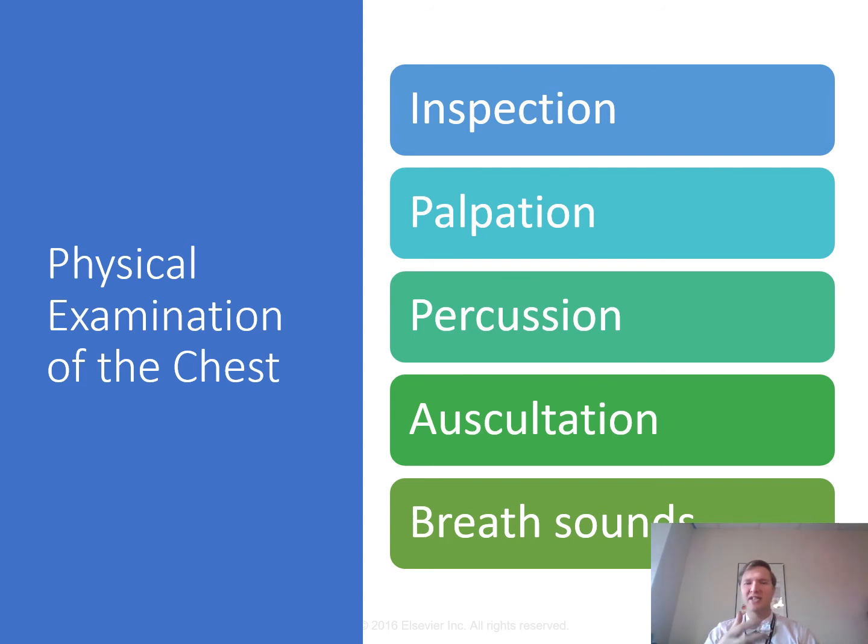So if something significant is changing in this patient's appearance or physical examination, then maybe that's a time to discuss with the care team the appropriateness of getting a chest x-ray. Right? Patient assessment should include respiratory muscle use. Look at the patient. Are they still working hard to breathe on the ventilator? They shouldn't be. If they are, you're not doing it right, right?